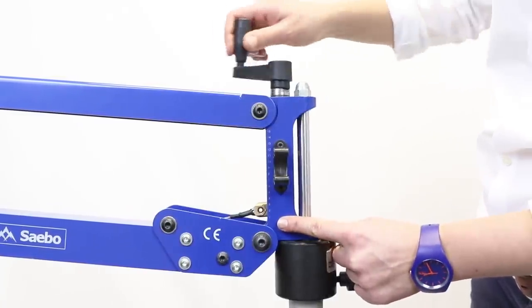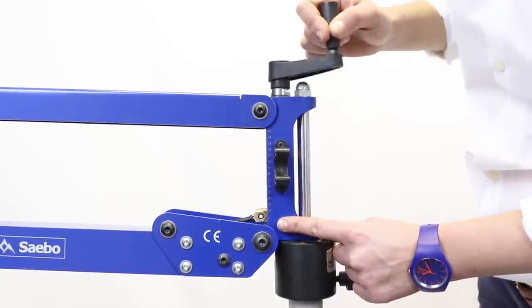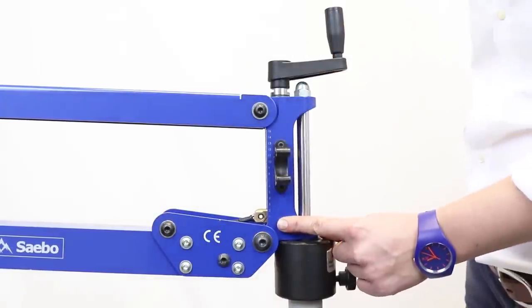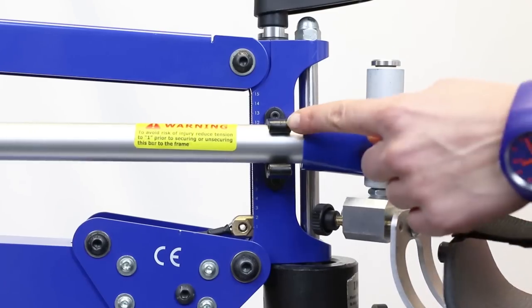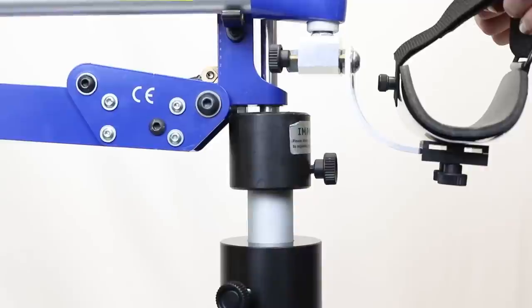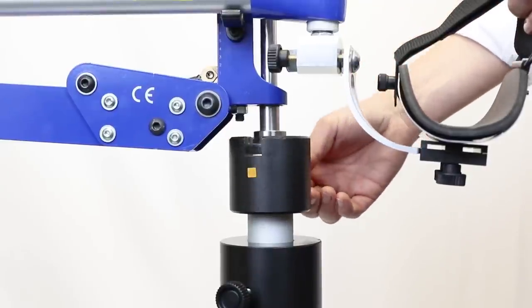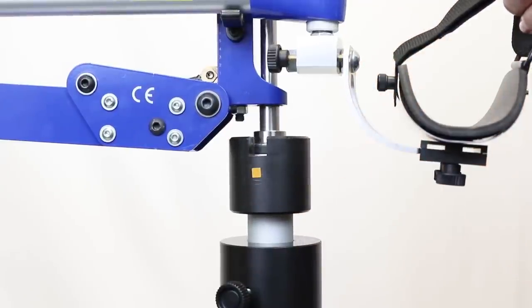Make sure that the tension scale is reduced all the way down to one. Next you need to unclip the parallelogram followed by undoing and sliding down the anti-swivel device to ensure that the parallelogram is free to move.